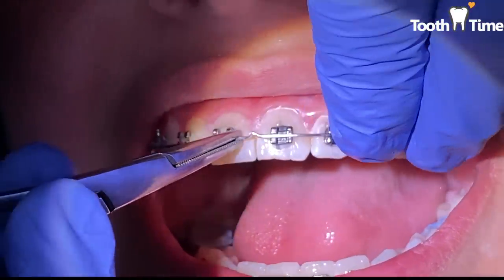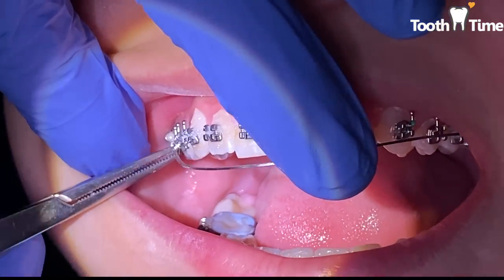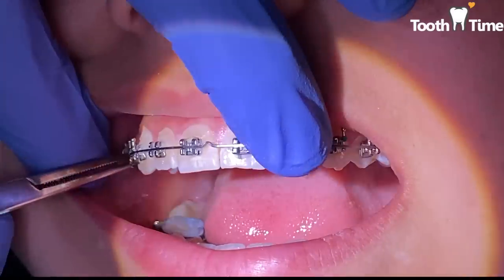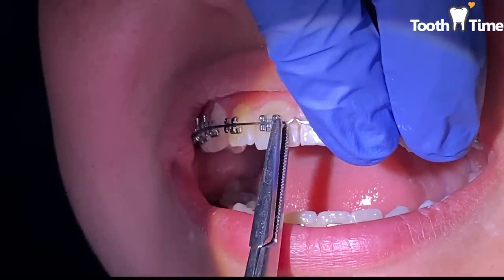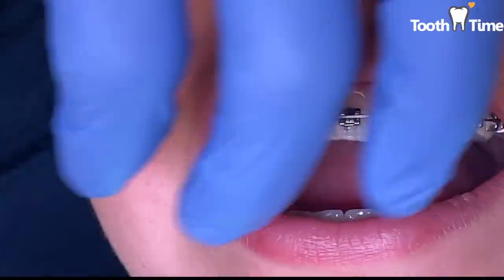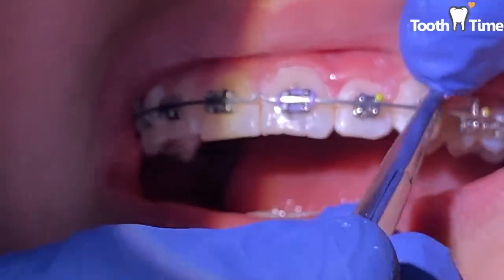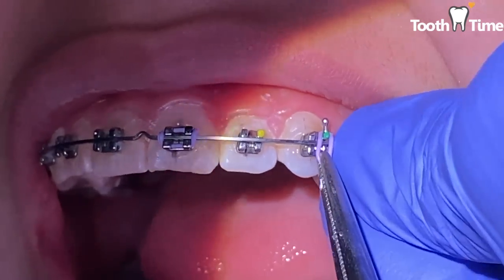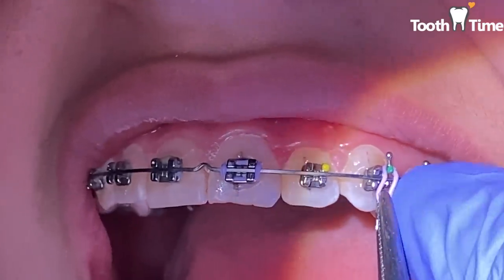We'll place the wire back on and place a single. The patient is asking for patterns — patterns are like red, blue, red, blue or pink, red alternating. Solids are like a solid red on top, a solid pink on bottom. Feel free to always request whatever color you like. Your dentist is usually very open to whatever you want — three colors, four colors, patterns, solids, one color on the left, one on the right. Maybe you want red, white, and blue since the 4th of July is coming up.